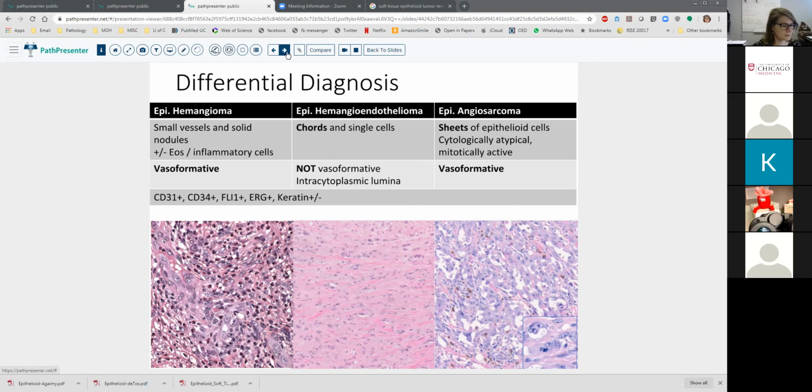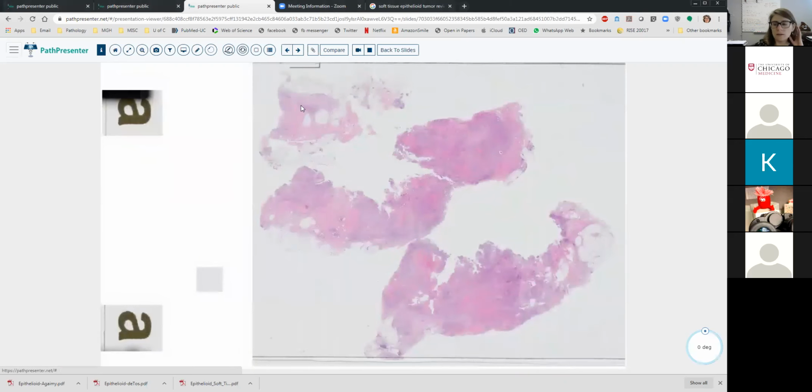All right. Anybody else have anything? Okay. Can you necessarily use that for hemangioendotheliomas? I've not used it for hemangioendotheliomas because I think the morphology in those can be so distinct. Yeah. But we've actually used it to differentiate hemangioma from angiosarcoma.